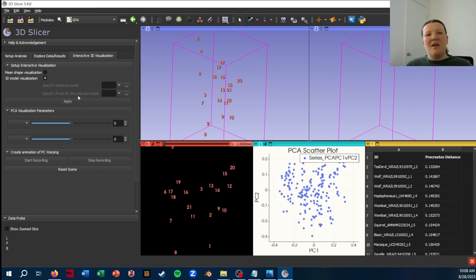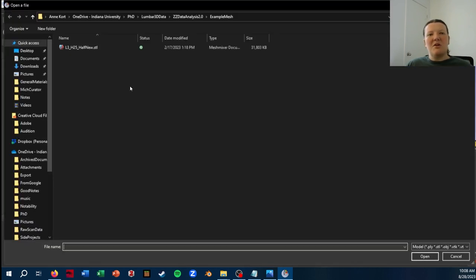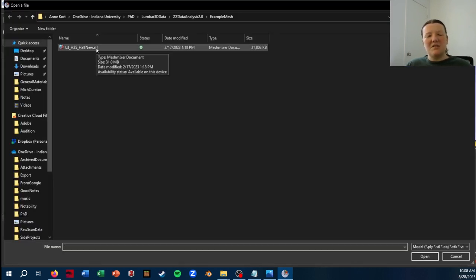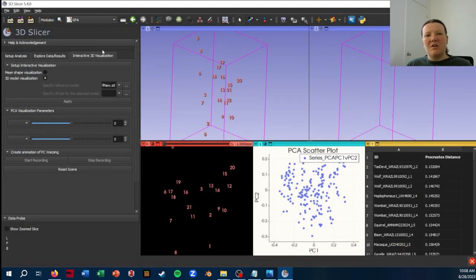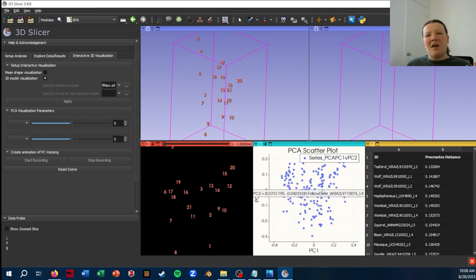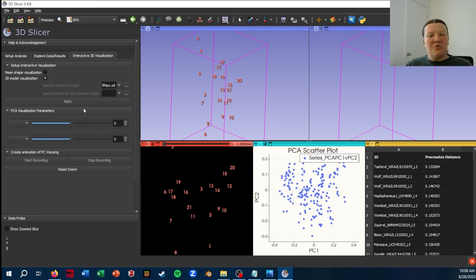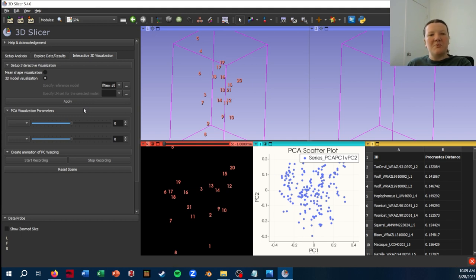So I'm going to switch from mean shape visualization, which is what you're seeing now, to 3D model visualization. And then I'm going to load in what is called a reference model. So I already have one set up. This is the third lumbar vertebrae from a beaver and I've selected it because when I was looking at my data the first time I found that the beaver was pretty close to the mean shape. So it makes a good reference model, which can then be warped to visualize the different shapes across the PC in the morphospace.